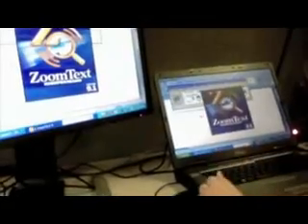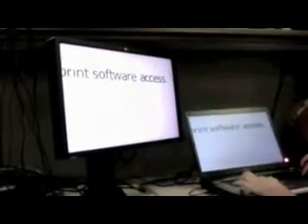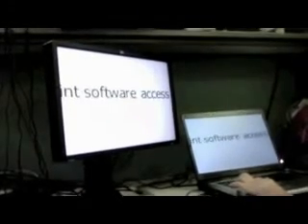trying to make adaptations, I am going to run a specialty package. I'm going to load it. You'll see Zoom Text come up. And then I'm going to minimize it because I can do what I want to show you without the overlay there. Okay. So now I can make it larger. And I'm going to scroll back so we try to keep the print larger, larger. And every time I hit the key combination of Alt plus, I'm getting larger print on my monitor.